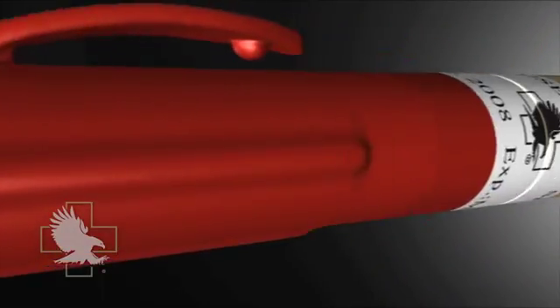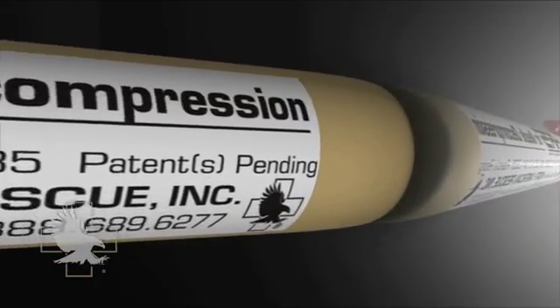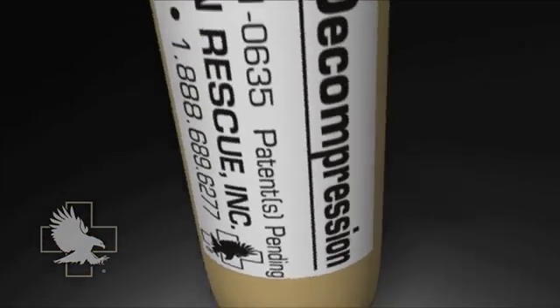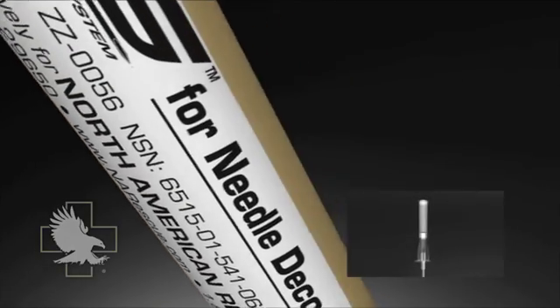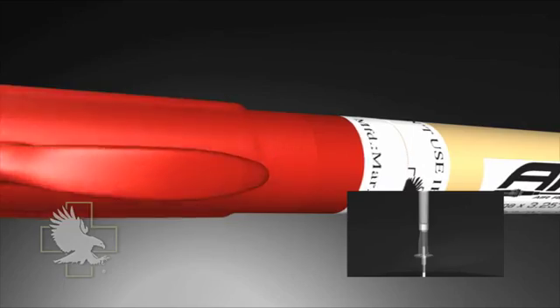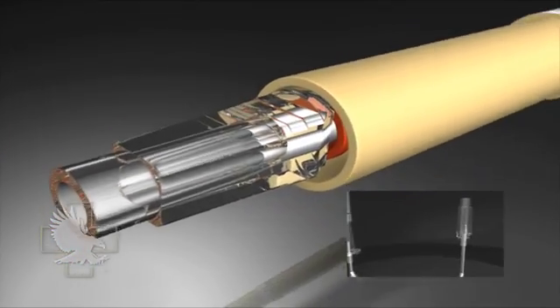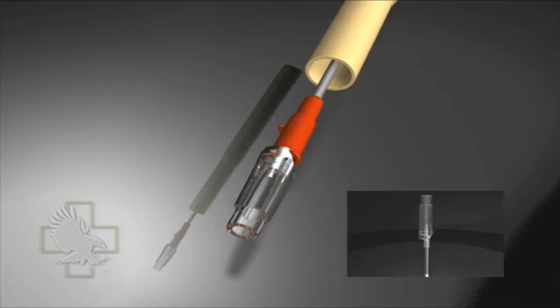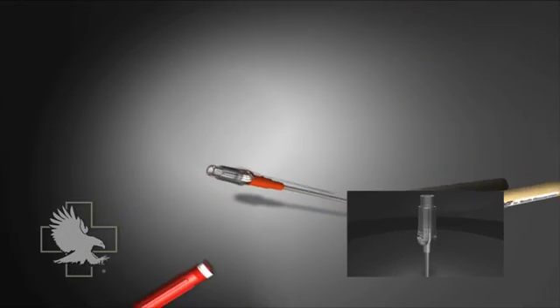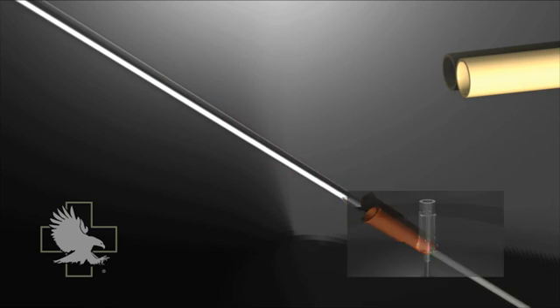The ARS Needle Decompression Kit includes a 14-gauge, 3¼-inch needle catheter with the flash chamber cap removed. Unlike a conventional angiocath system that incorporates a flash chamber cap intended to prevent excess blood loss during vascular access procedures, the cap has been removed from the ARS due to reports that during heightened stress, operators did not remove the flash chamber cap from the standard angiocath, rendering the procedure unsuccessful.